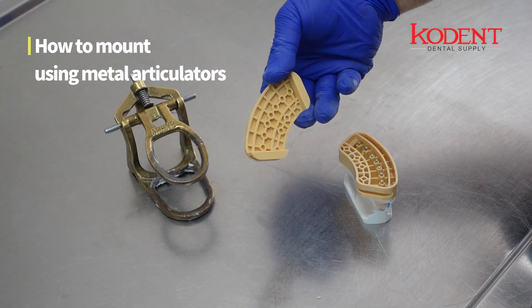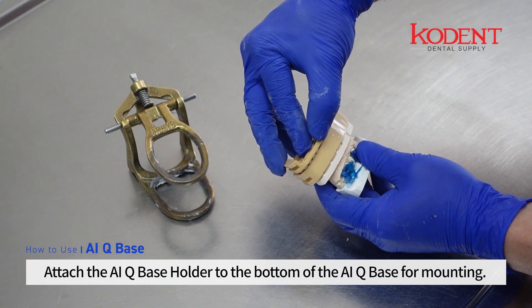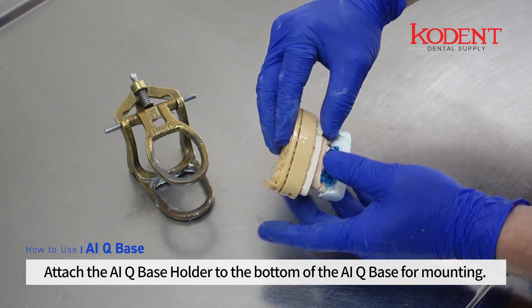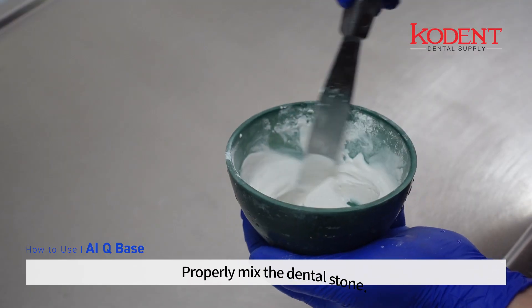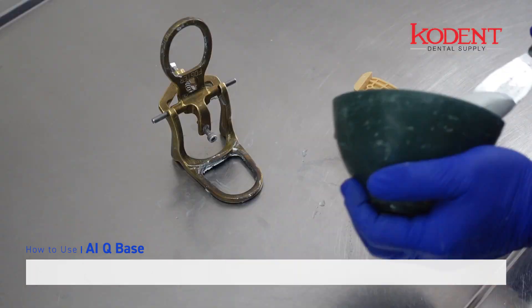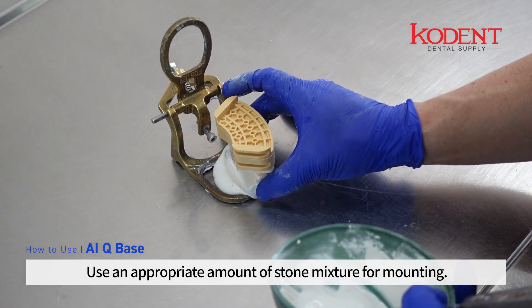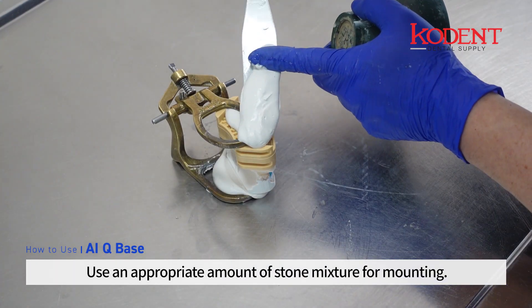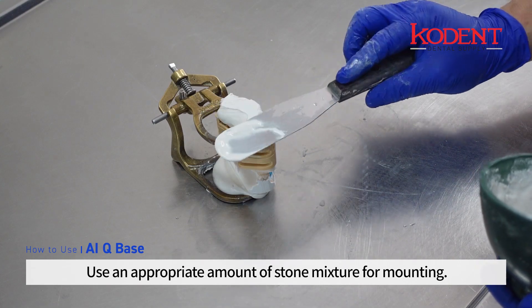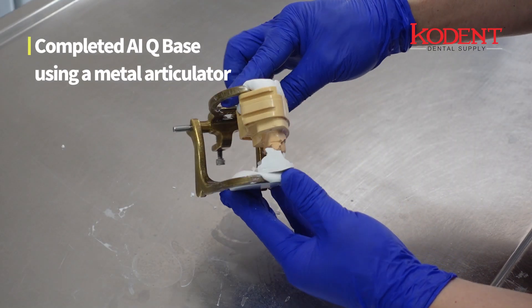How to mount using metal articulators: attach the AIQ base holder to the bottom of the AIQ base for mounting. Properly mix the dental stone and use an appropriate amount of stone mixture for mounting. This produces the completed AIQ base using a metal articulator.